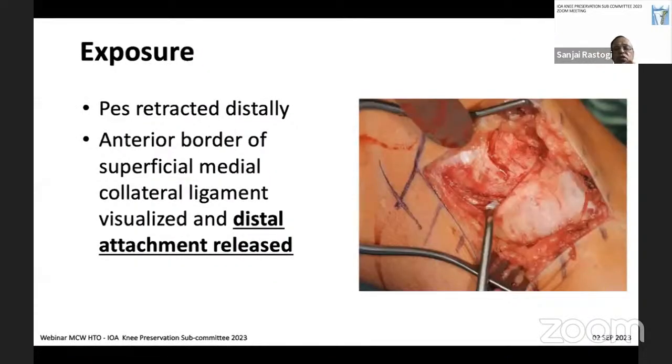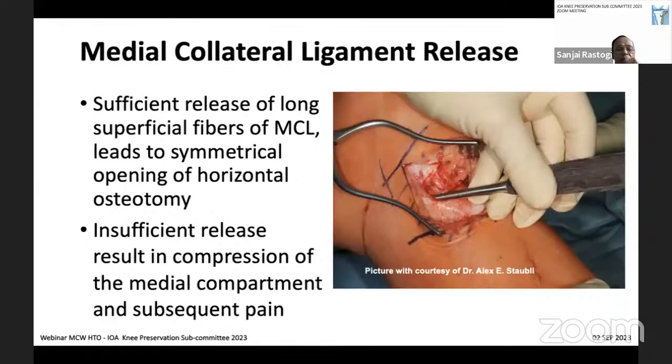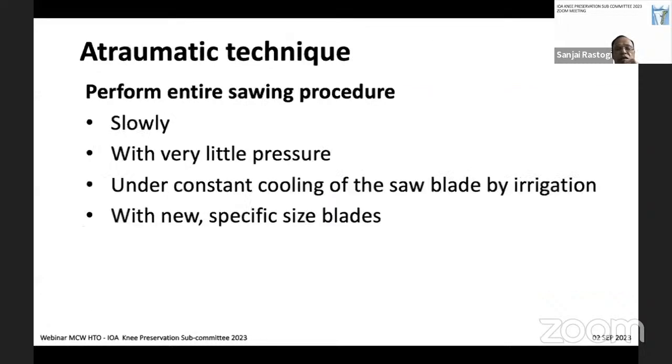And for this, we retract the pes anserinus distally and raise this MCL, to avoid knee pain on the medial side later. The osteotomy should be done by an atraumatic technique. The entire sawing procedure should be done slowly with minimal pressure under constant cooling to avoid thermal necrosis, with new blades, because that also helps to decrease the heat.